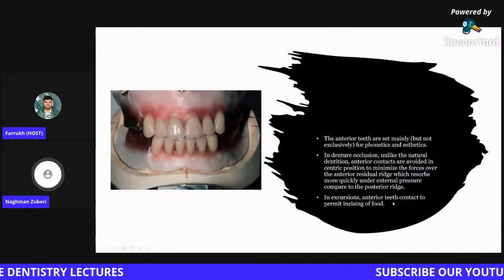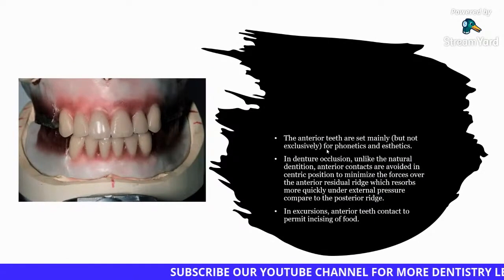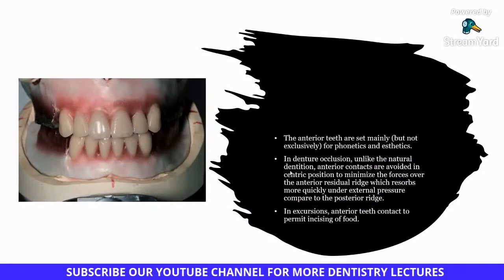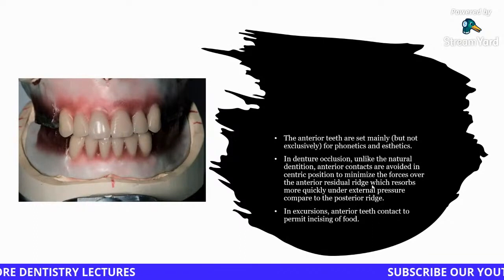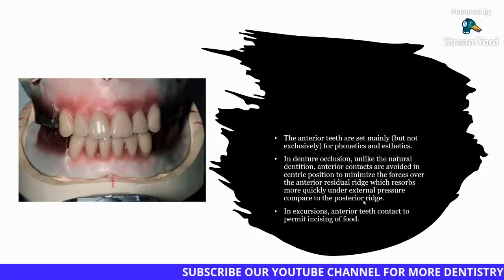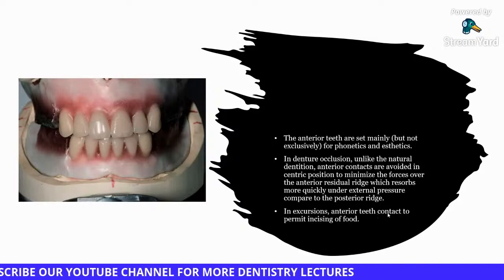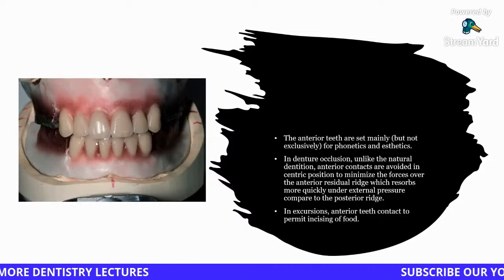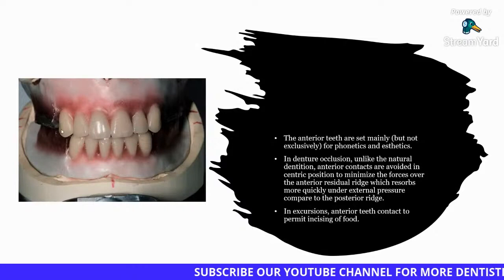The anterior teeth are set mainly but not exclusively for phonetics and aesthetics. In denture occlusion, unlike the natural dentition, anterior contacts are avoided in centric position to minimize the forces over the anterior residual ridge, which resorbs more quickly under external pressure compared to the posterior ridge. In excursive movements, anterior teeth contact to permit the incising of the food, but there should be counteracting of the fulcrum, which will be there.